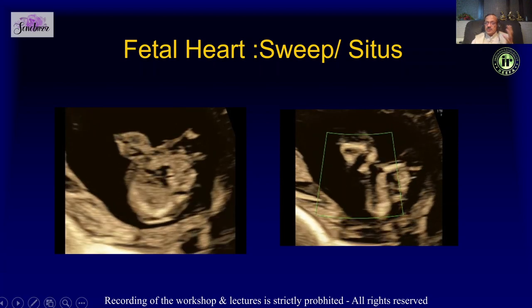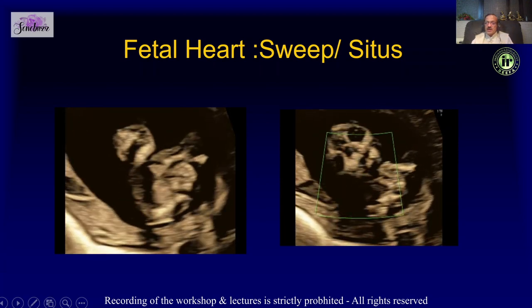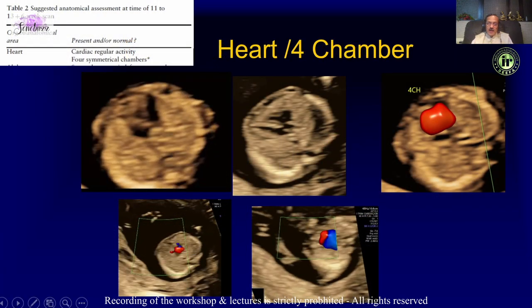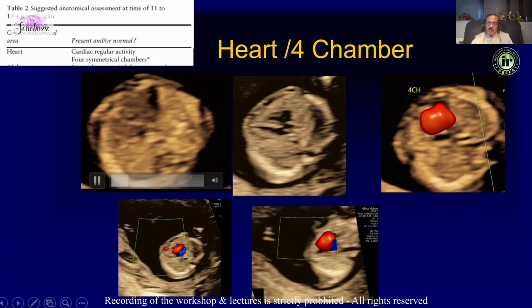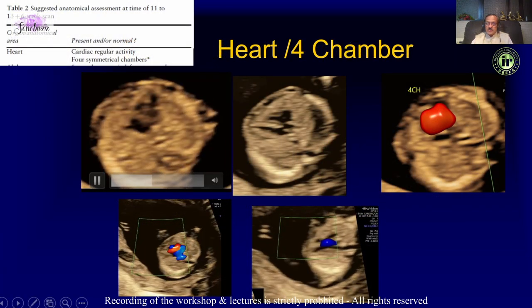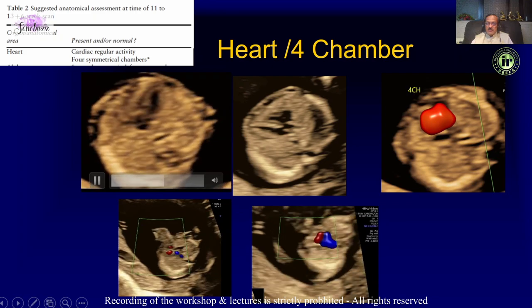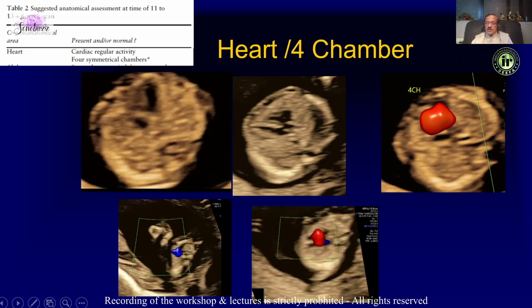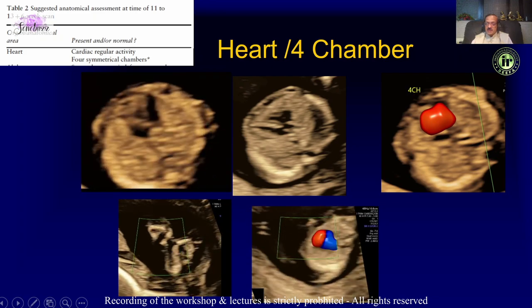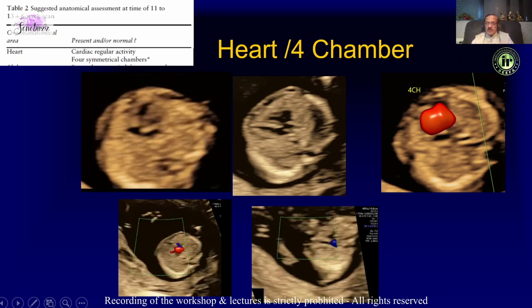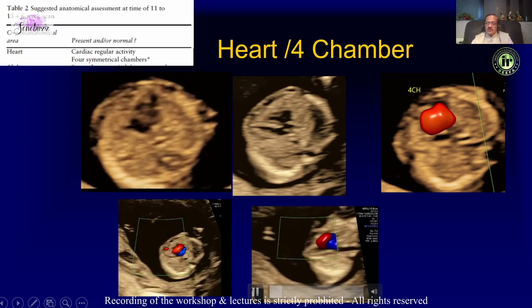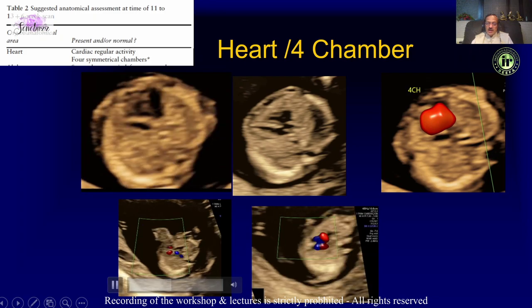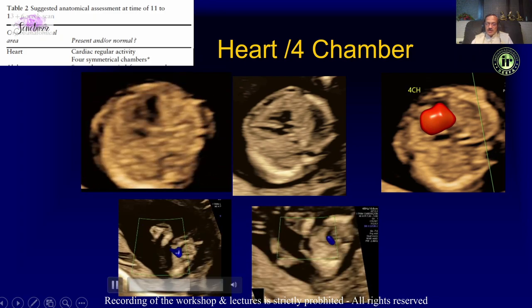After taking a sweep, nowadays with high-frequency probes and even basic probes you can see the four chambers and the interventricular septum well if you hit it perpendicularly. It is also a good habit to switch on color and look at the four-chamber flow to make sure your settings are correct.